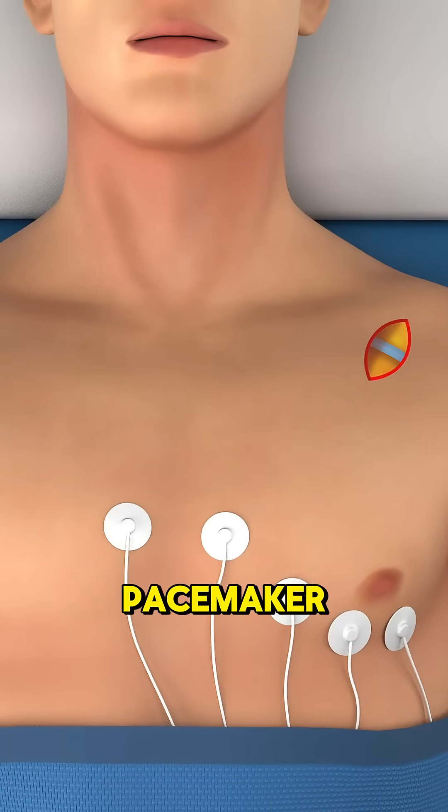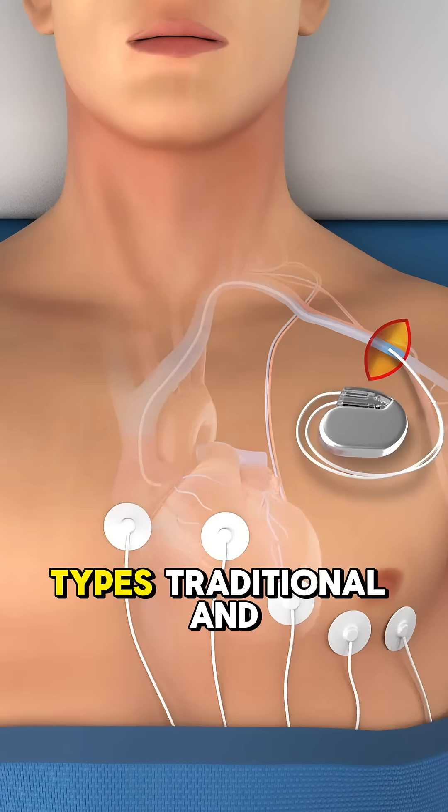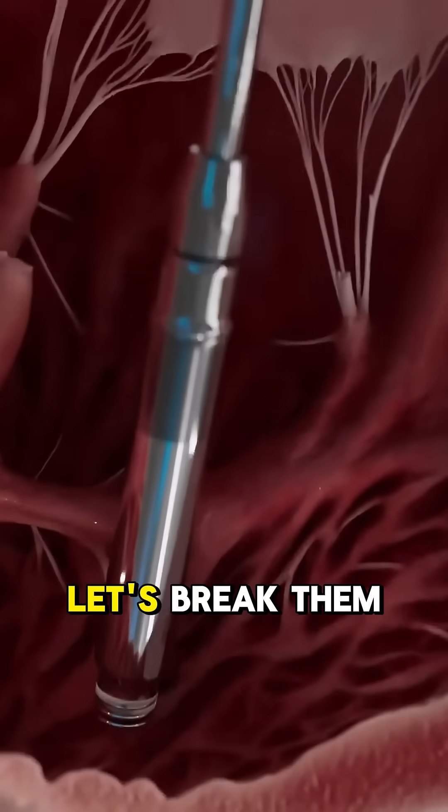Ever wondered how doctors implant a pacemaker to keep your heart beating smoothly? There are two types: traditional and leadless. Let's break them down.